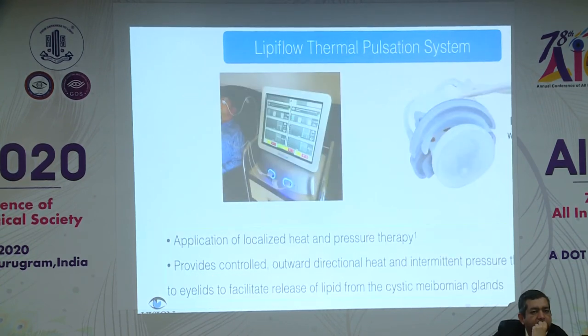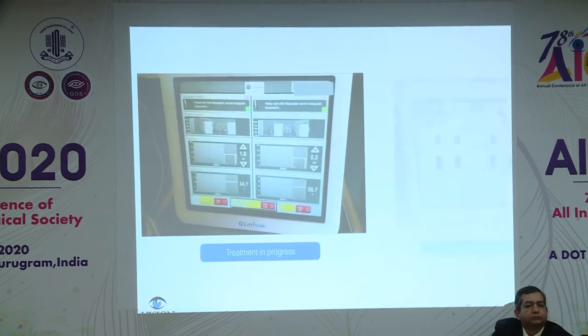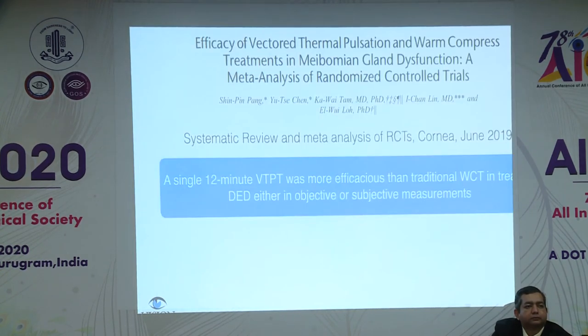The vector thermal pulsation that LipiFlow has does bypass that. What it does is it gives heat from the inner surface, pressure from the external surface. It's about a 12-minute cycle. There is literature that supports its efficacy as well.